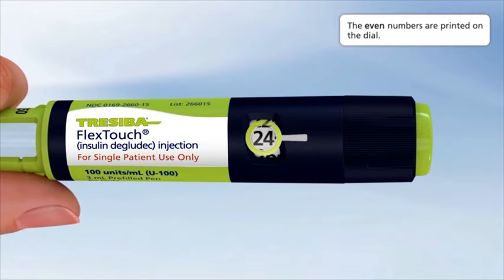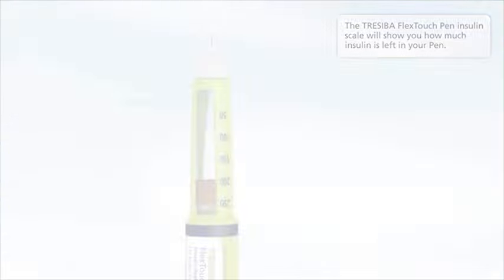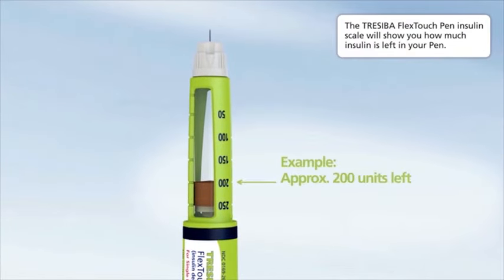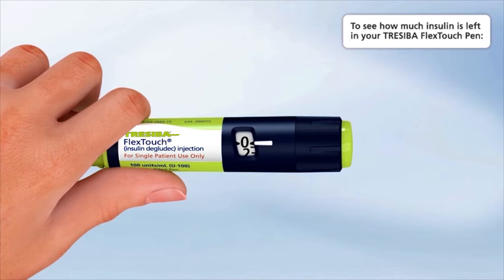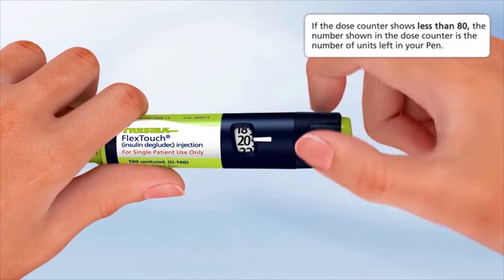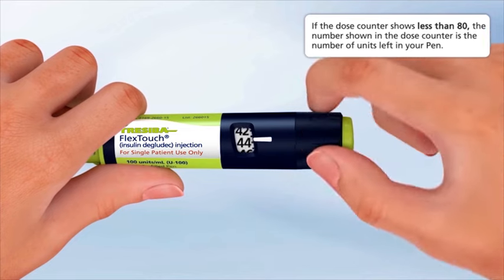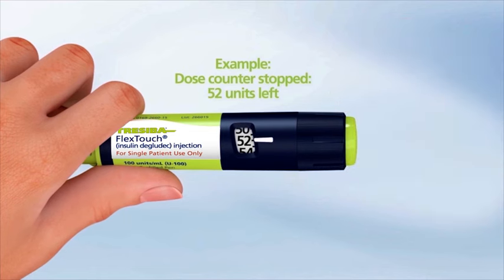The even numbers are printed on the dial; the odd numbers are shown as lines. The Traceeba FlexTouch Pen insulin scale will show you how much insulin is left in your pen. To see how much insulin is left, turn the dose selector until it stops. The dose counter will line up with the number of units left in your pen. If the dose counter shows 80, there are at least 80 units left. If the dose counter shows less than 80, that number is the units left. In this example, there are only 52 units left, so the dose counter stops and you can't dial past 52 units.